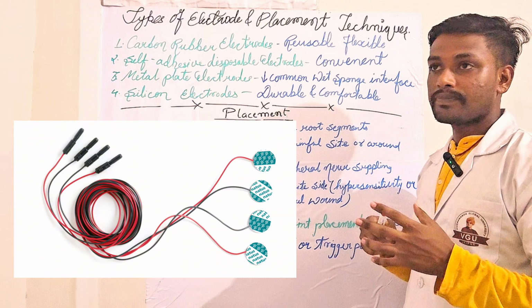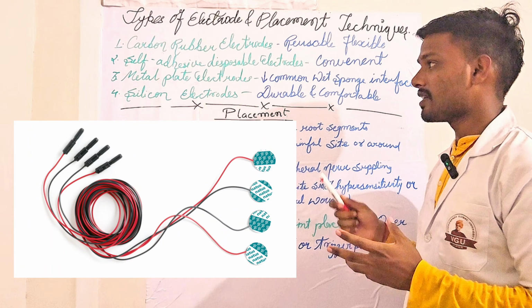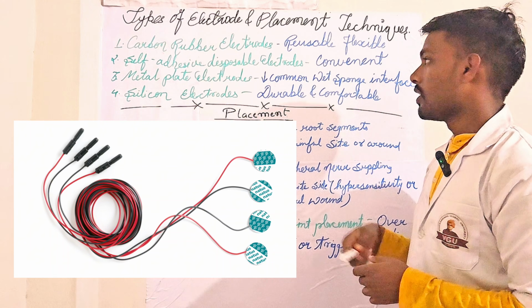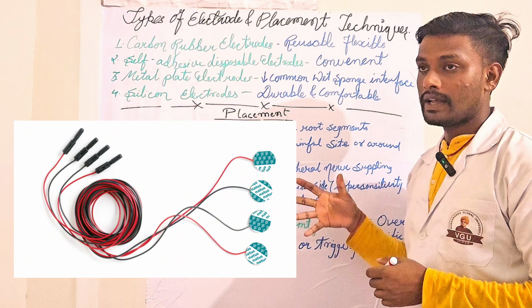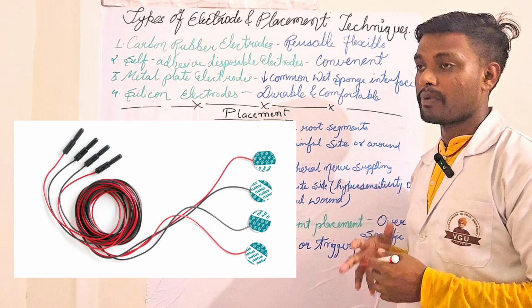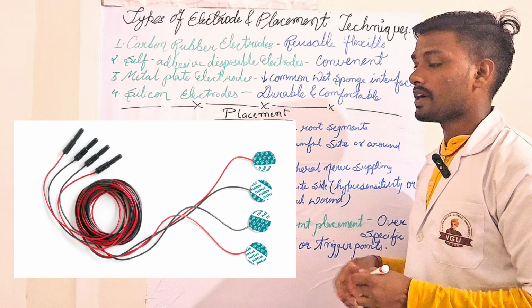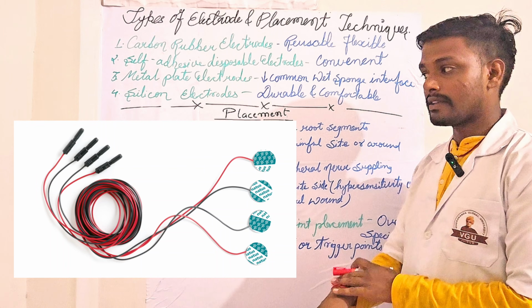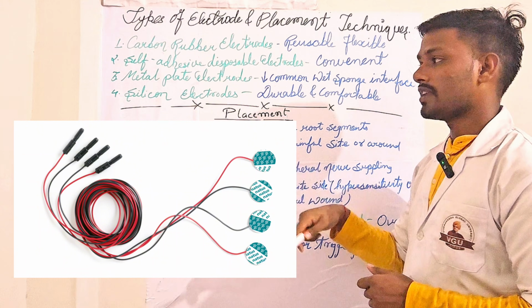So it does not cost much. It is usable a single time on a single patient, or convenient for a particular patient who is high-end, or a patient who pays a larger amount for their treatment. Self-adhesive electrodes work without any gel, they can be placed over the dermatomal and neural region, so they can send the signal of pain relief there.